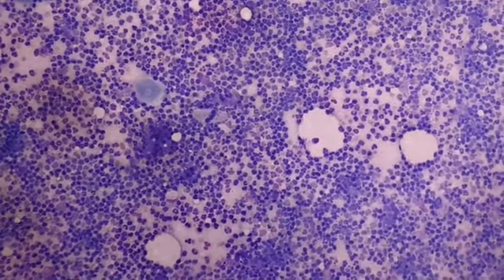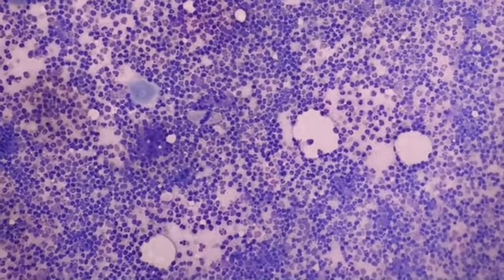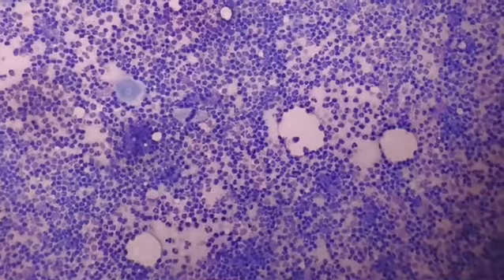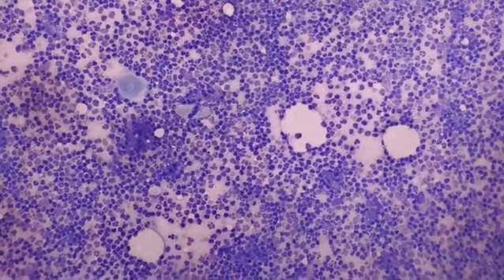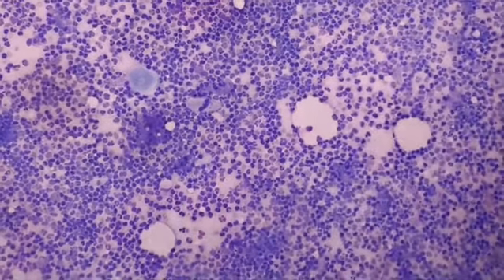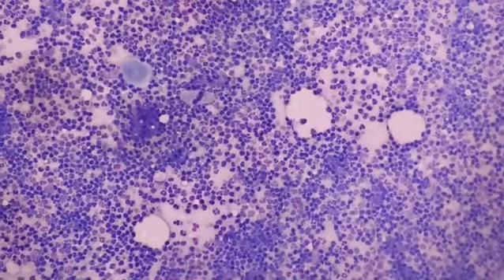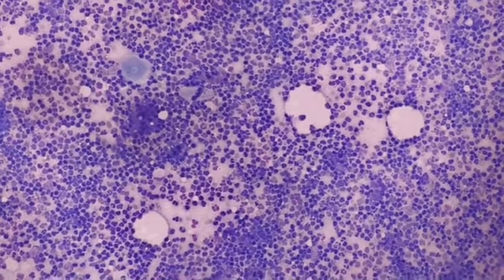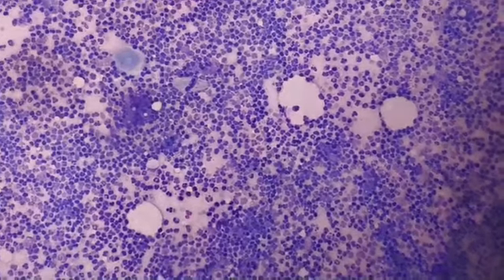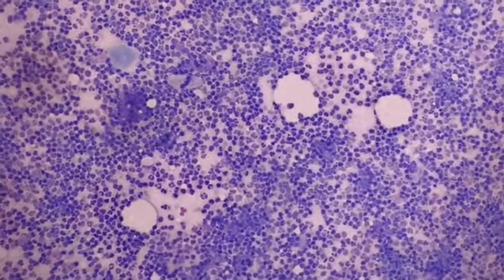That is a painful condition, but the crux point to be noted is that you have to differentiate it from inflammatory carcinoma breast. If it had been an inflammatory carcinoma, we would have seen scattered pleomorphic cells also along with this dense inflammation. FNAC has a drawback: if we aspirate only from one or two sites, we are not able to hit the malignant region if it is inflammatory carcinoma.